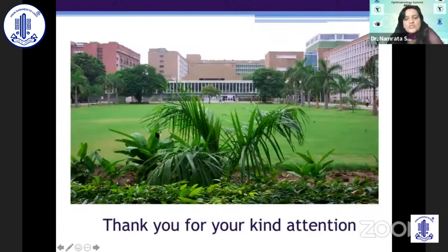So the intraop OCT microscope is a great tool to have. It is like a third eye. It helps you to see things which earlier you had to imagine, and it gives you a third dimension into the whole dynamics of your intraoperative surgery. And it is here to stay, and I'm sure it will refine further and become better.